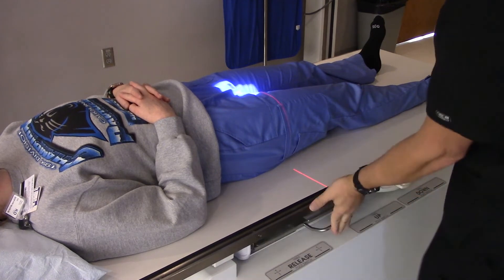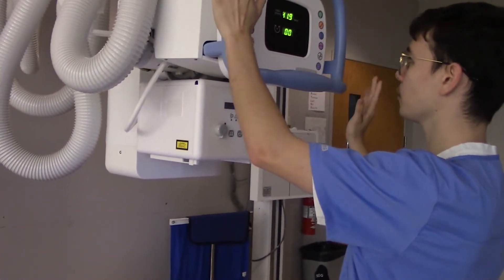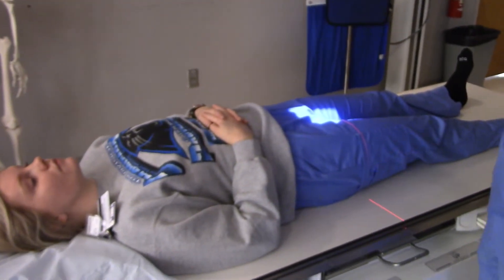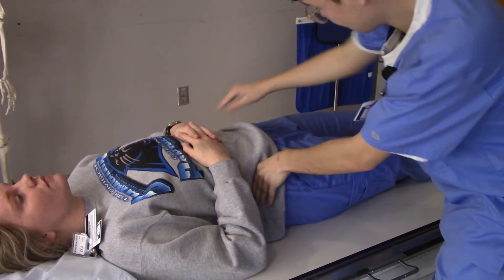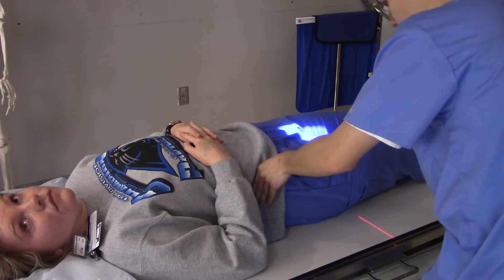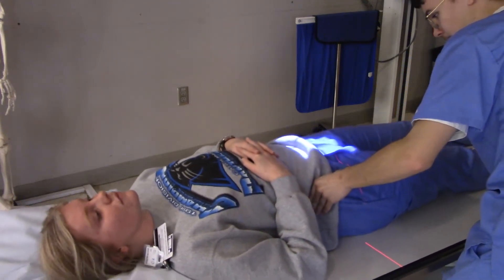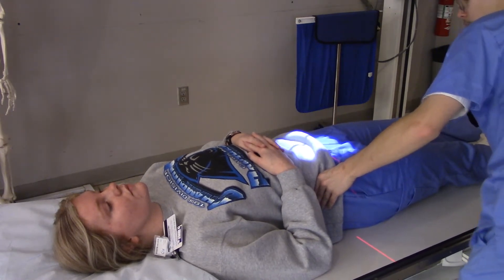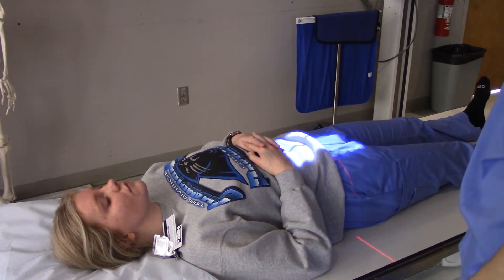40-inch SID exactly, and that readout is accurate. I'm going to feel on your side — I think that's your ASIS right there. On most patients, even if they're somewhat overweight, the ASIS is generally pretty prominent. We're going to line up with the mid-sagittal plane.